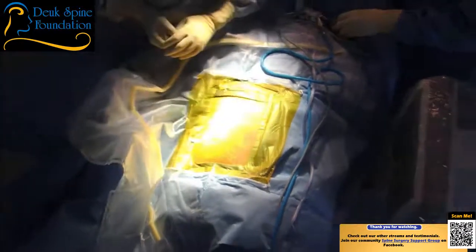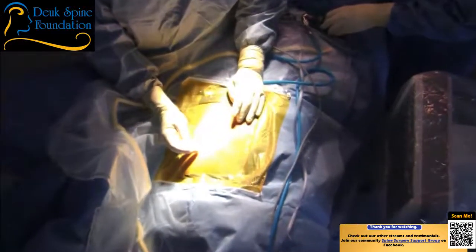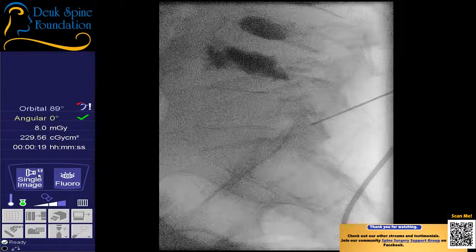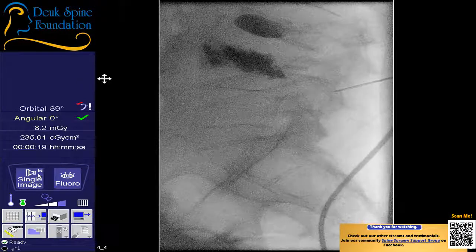Shot. Shot. We're so close. Just so much arthritis here.